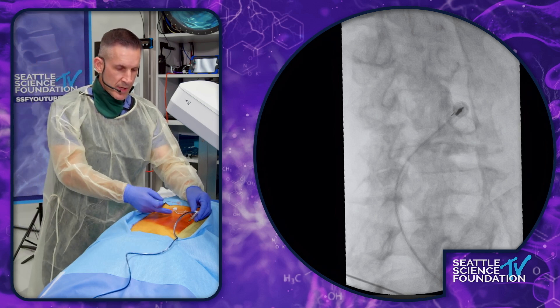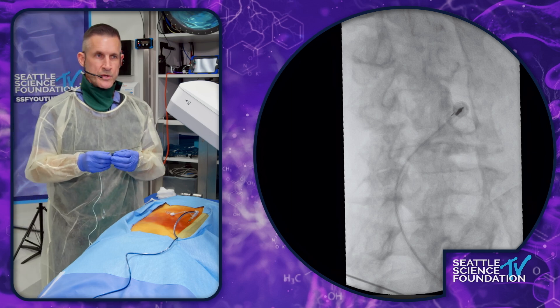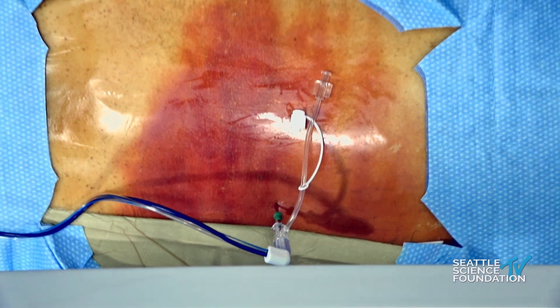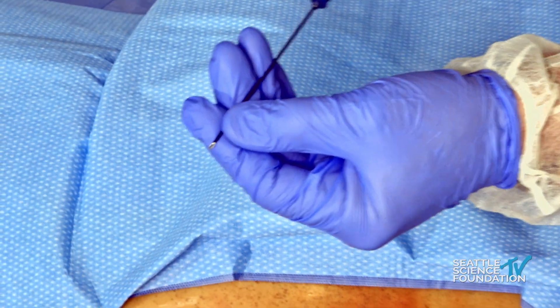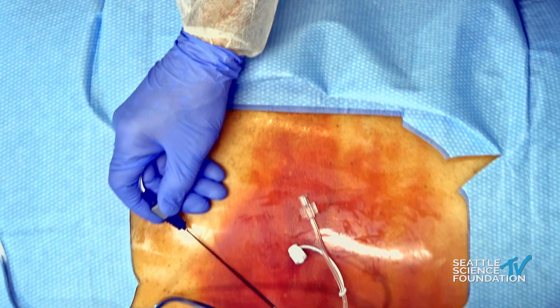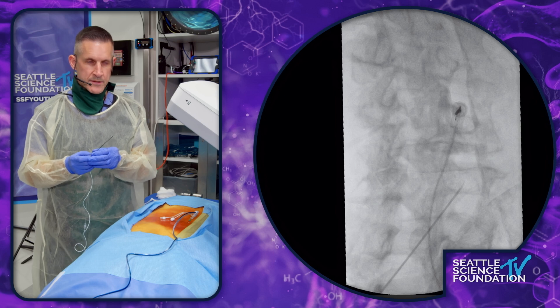This is something that I do in the hospital setting. If I want a more cost-effective option, this is the Trident, which is a newer tool that Avanos has acquired. It's a little bit different to drive because it's got more of a bevel drive. What you'll see is this one is going to be more of a standard drive — it's going to have the bevel, so you're going to be able to directionally drive it instead of a diamond. But you're still going to be able to go down in a perpendicular fashion, just like I did on the other level. And you can still see it pretty well on the image.